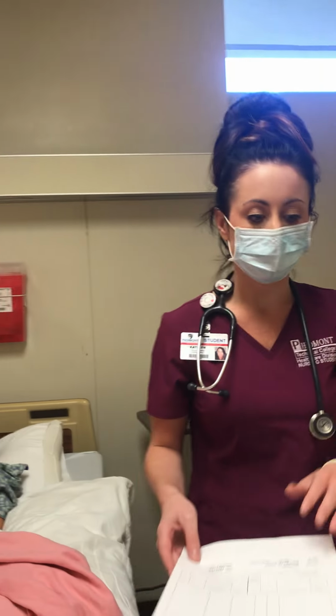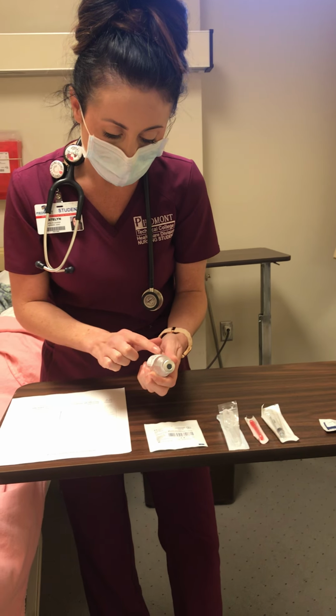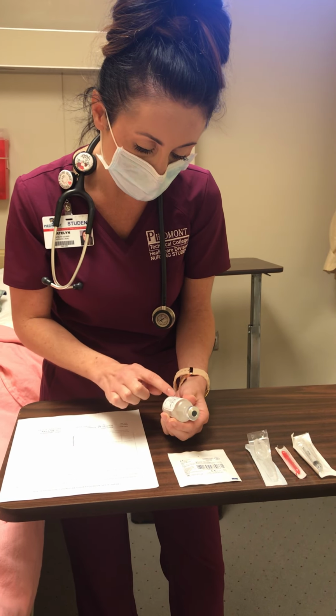Okay? So now I'm going to perform my third med check. So I have methylprednisolone, 30 milligrams. I have 40 milligrams.